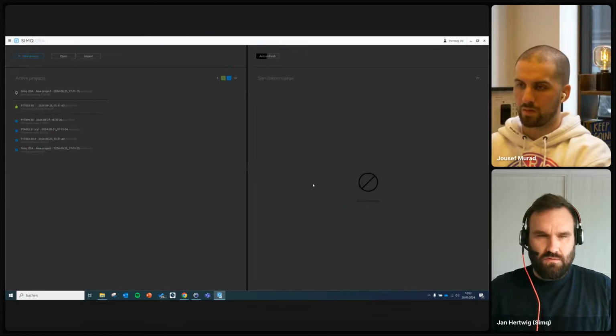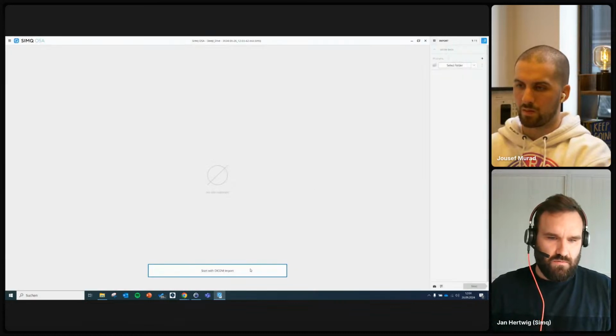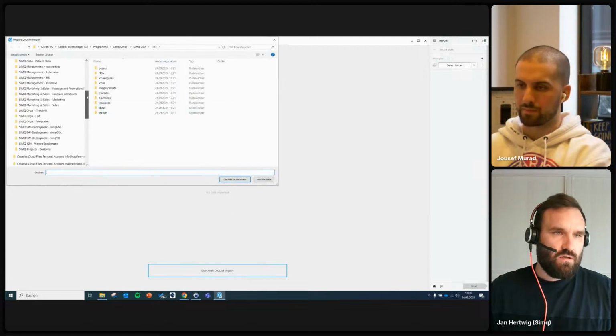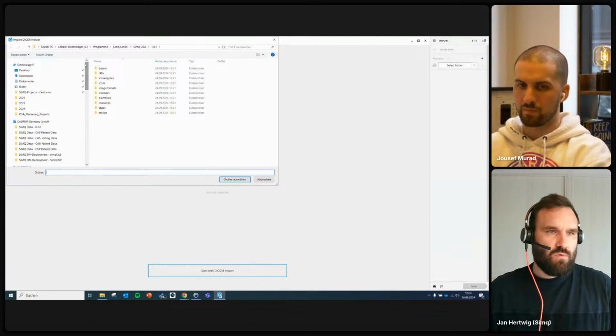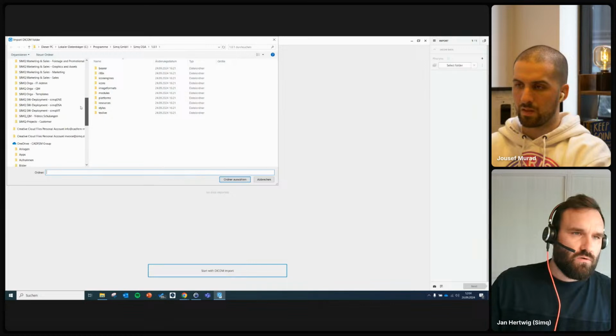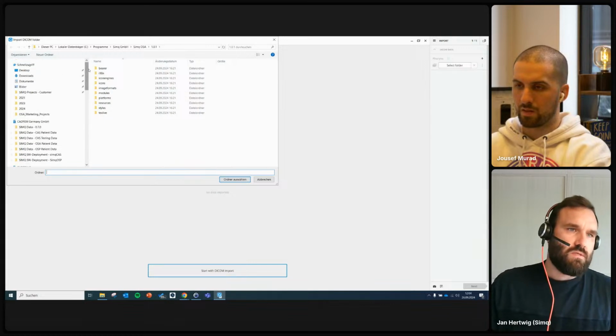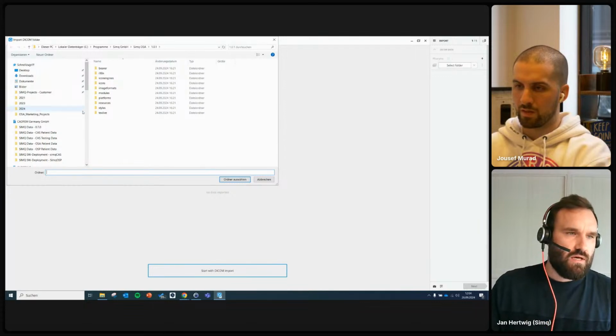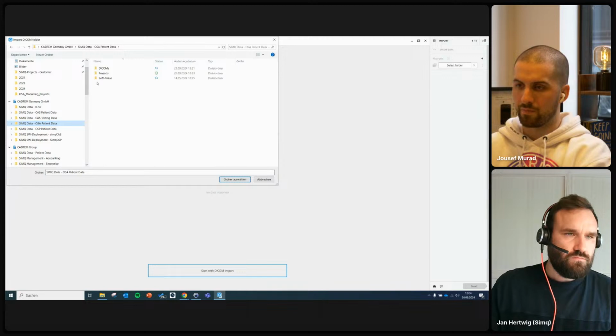And just save the base project. What you have to do is open DICOM, the DICOM stack from MRIs. In this version, and in the next version we are also including CBCT and CT data. That's just a different modality of patient data you can have, and you just import them.